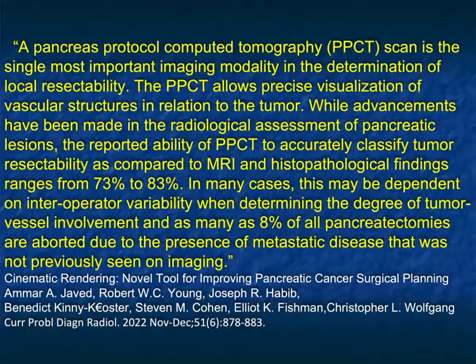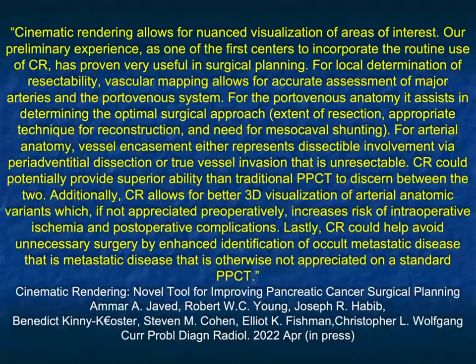And in this article, it made the point that surgical planning is much more accurate and you decrease inter-observer variability when you create these 3D maps. And that's something we routinely do for our practice. A quote here, cinematic rendering allows for nuanced visualization of areas of interest. Our preliminary observation and experience as one of the first centers to incorporate the routine use of cinematic rendering has proven very useful in surgical planning.